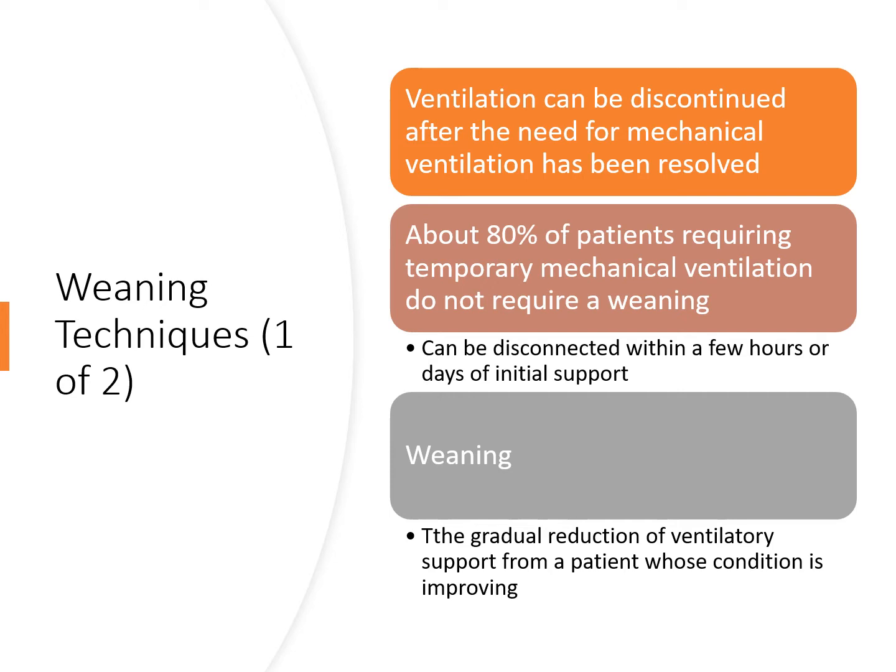So the big idea here is, why is this patient on the ventilator in the first place? Why are they spending so long on the ventilator? What are our goals? What stage are we in? Are we in stabilization? Are we in recovery? Are we in liberation? What phase of mechanical ventilation are we in? So we may not have to do days and days and days of weaning with most patients.